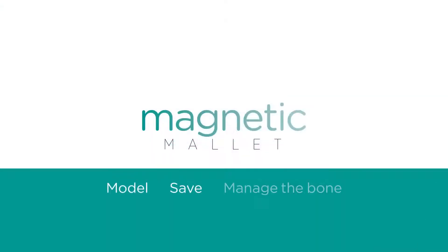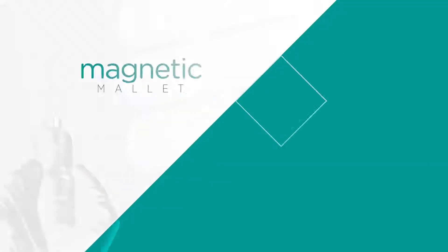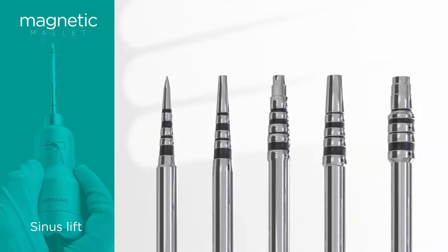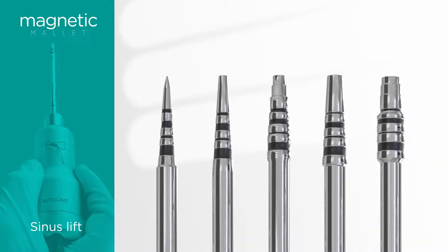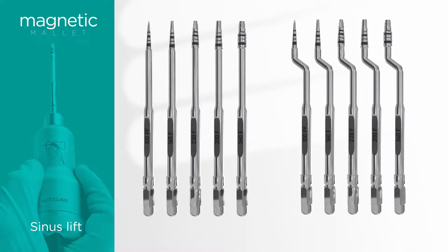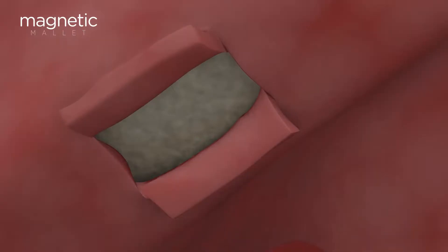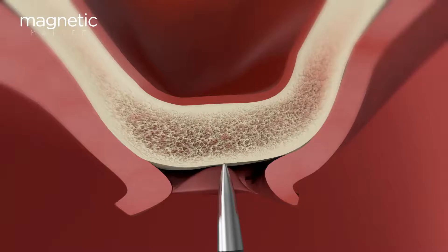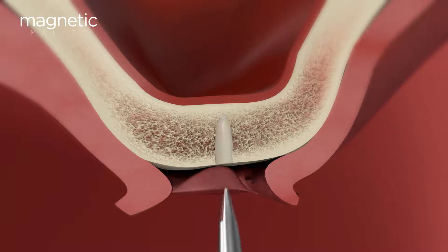The magnetic mallet is a device that simplifies the sinus lift procedure. The osteotomes kit has all the necessary instruments to complete the procedure without using drills or other tools that can cause bone loss. Using only one hand, you'll be able to direct the osteotome to the desired axis, benefiting from complete visibility and applying the four forces according to the bone density.